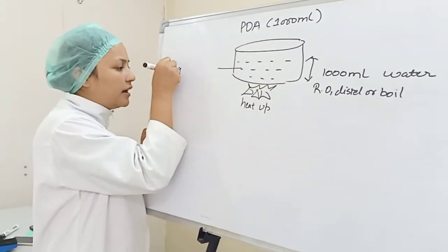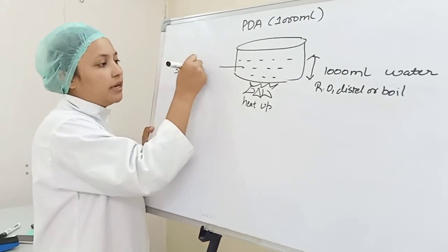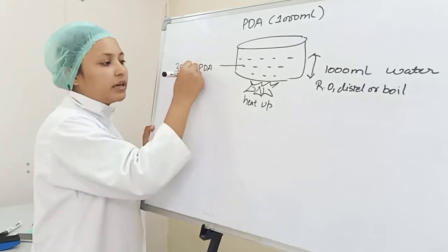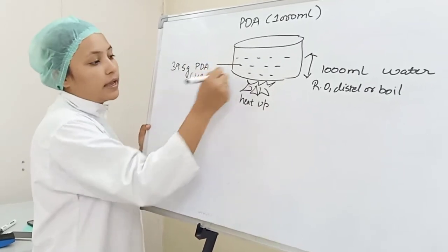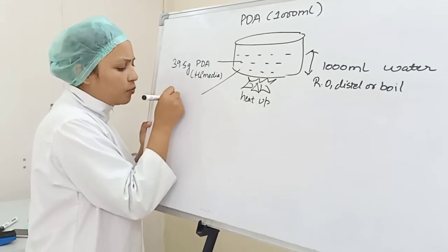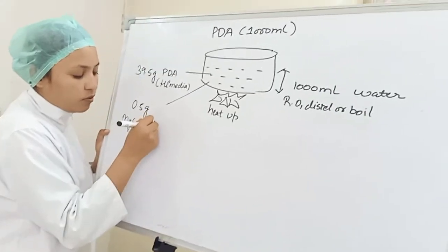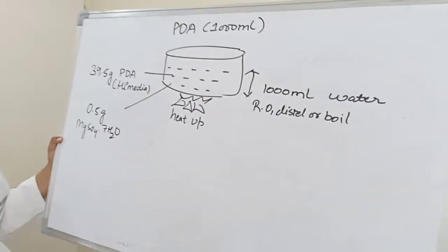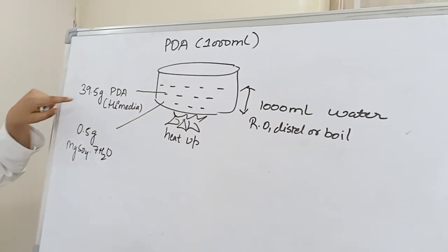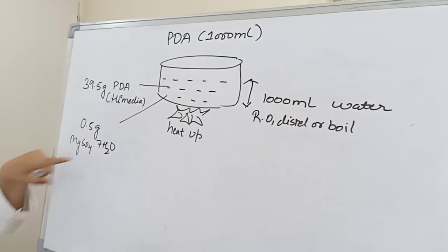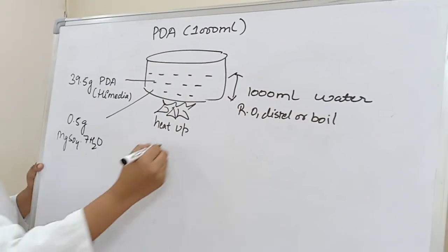We will add 39.5 gram of PDA powder and 0.5 gram of MgSO4.7H2O, it means Magnesium Sulphate.